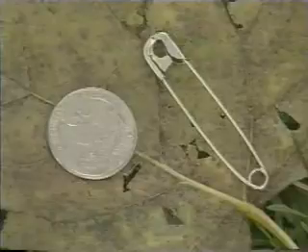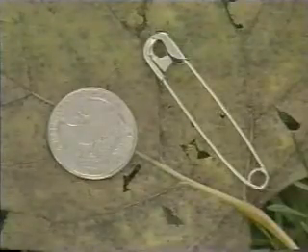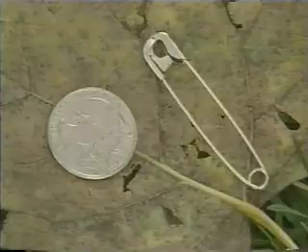Safety pins can also be used to remove a sliver from the skin, drain an abscess or blister, hold a bandage in place, or relieve a hematoma under a fingernail. Large sizes — number three — are preferred.